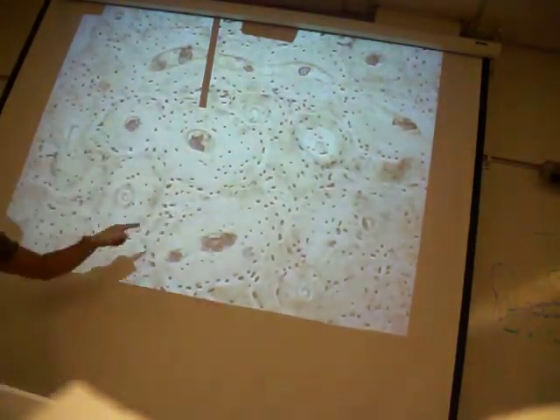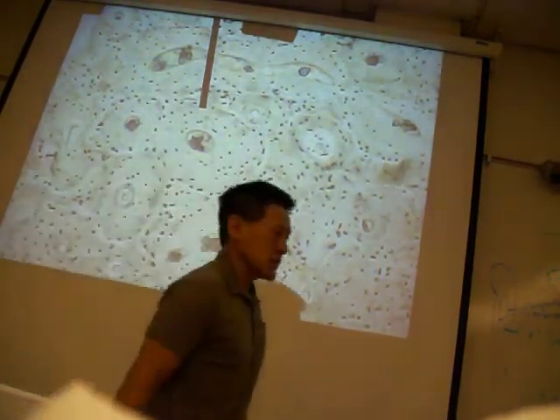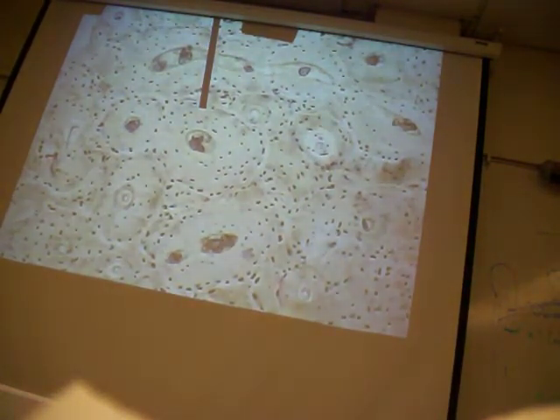Now the question is, you've got to get nutrients out there. The arteries, the veins, the blood supply is here in the osteon canal. How are you going to get it all the way out here to the lacunae? If you look, one of the things you'll see is what looks like a little tributary system that kind of comes up.